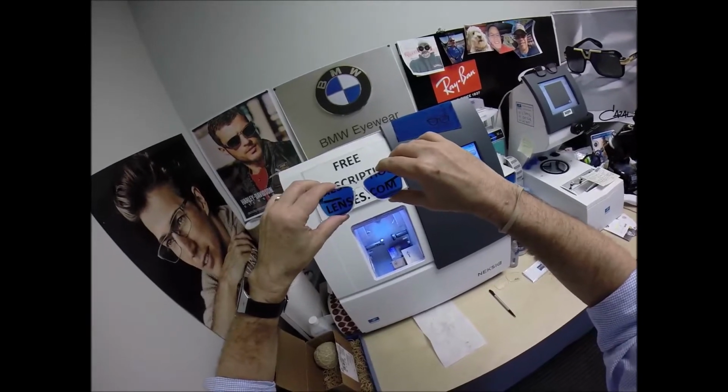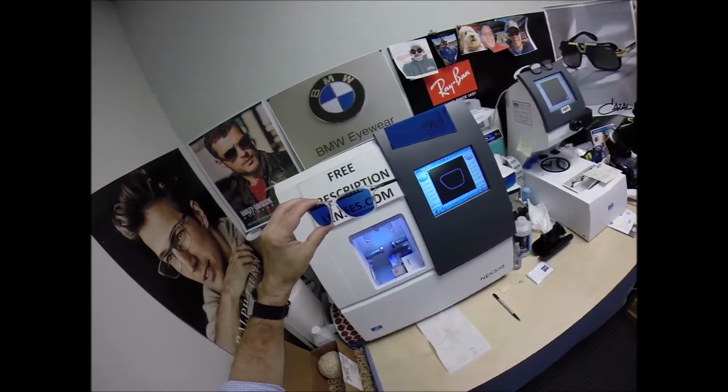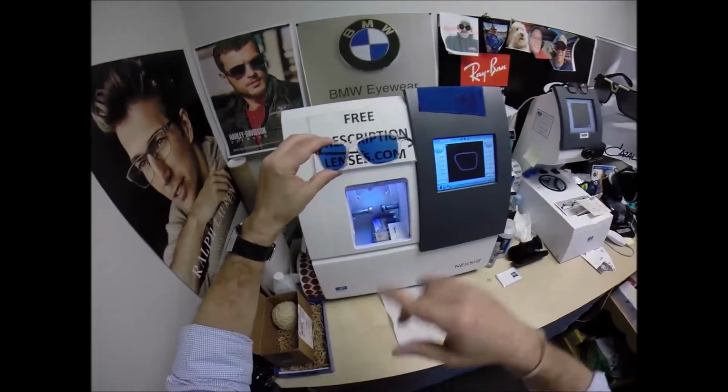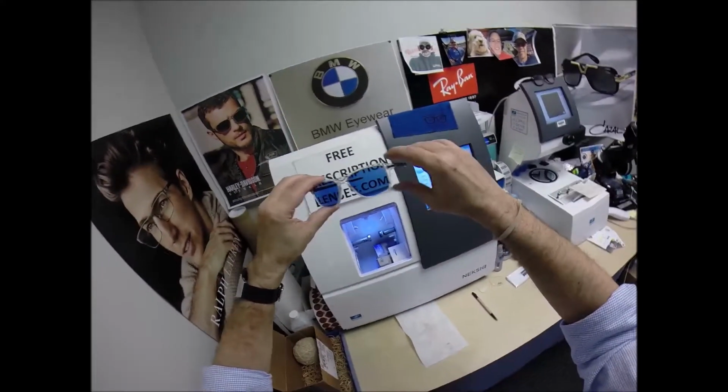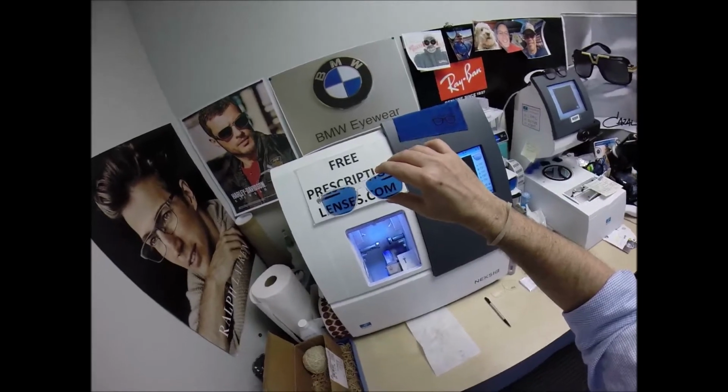Now, if you have the PhotoFusion Extra Gray or the Transitions Extra Active in gray or brown, they will get 30 to 50% dark behind a windshield. Now, if you have a convertible or a motorcycle, all lenses will darken. And as soon as you step out of your car, they will. And of course, as I keep talking, you'll see these turning back to virtually clear.